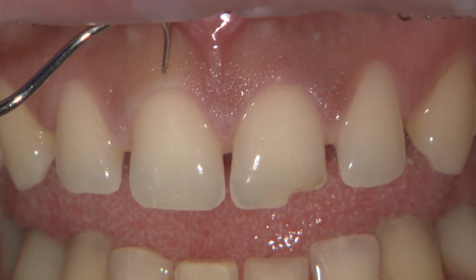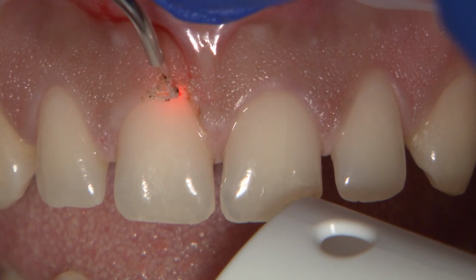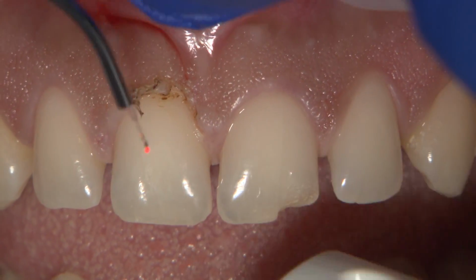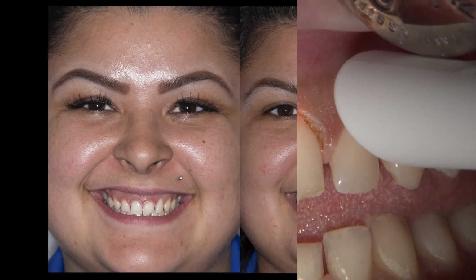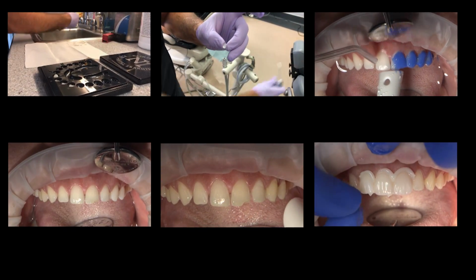We can see here that the gingival margins of the centrals are still lower than the laterals, so we can go ahead and recontour it. The correct position for the gingival margins was determined using tooth proportion beginning at the reference of the correct incisal edge location. The information was transferred to a model and another snap-on trial smile was created to show the patient the ideal result. Patient was asked to return in 6 weeks. Join me in the next episode for final delivery of 10 no-prep BruxZir Esthetic veneers.